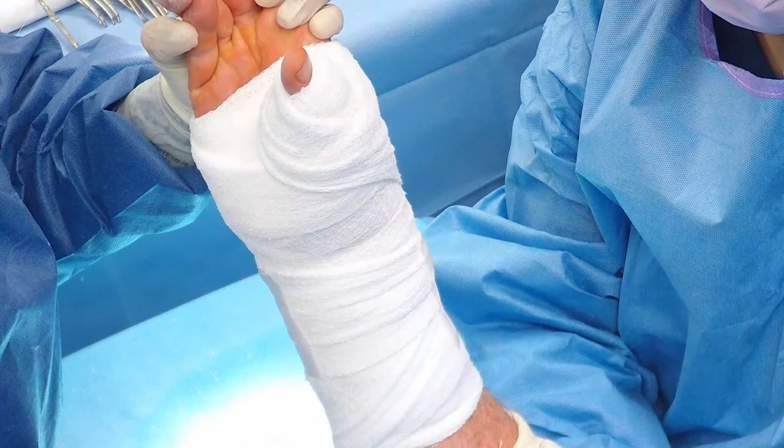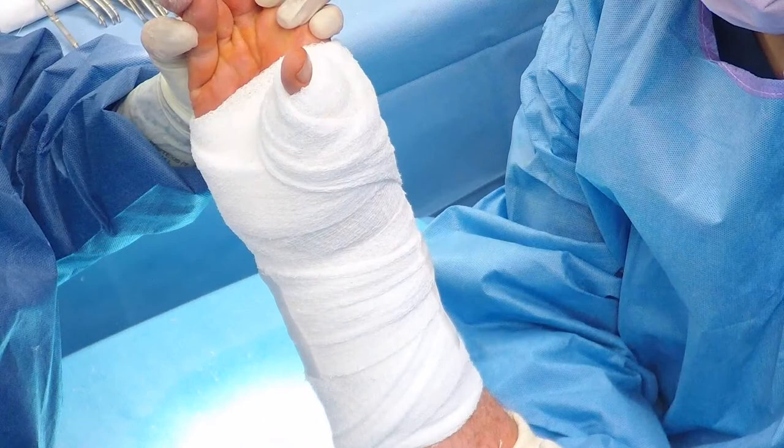A well-padded thumb spica short arm plastic splint is applied. Final x-rays demonstrate excellent position of the implant as seen here.